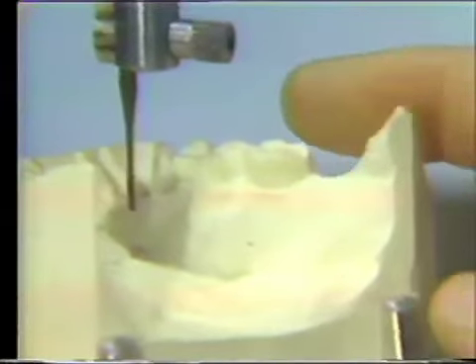Now, as we look at the lingual surface, we find that there is a slight undercut in the cervical third of that crown. This tooth is caries-free, and the root shape is such that we probably will not have to splint it to the adjacent tooth. So keeping this in mind at this point, we see there's a slight undercut, but we could probably, with very little planing, get a nice parallel surface on the lingual of this tooth.